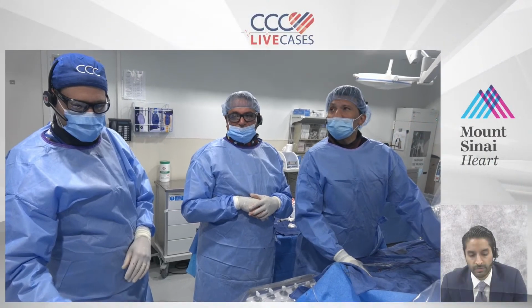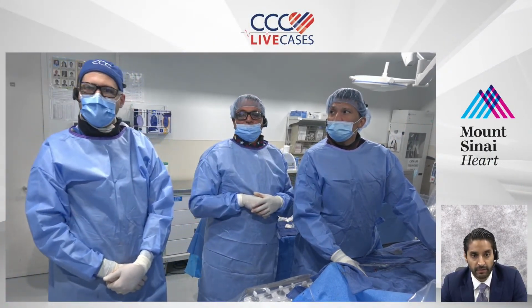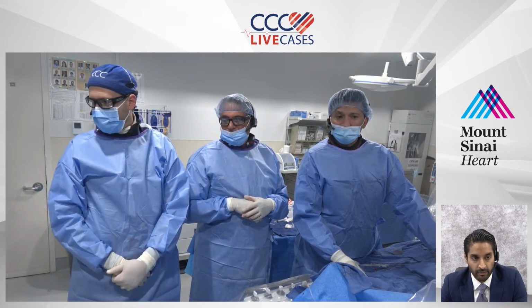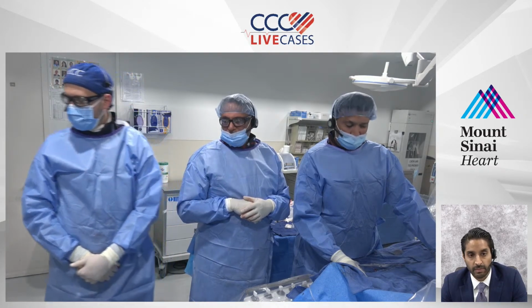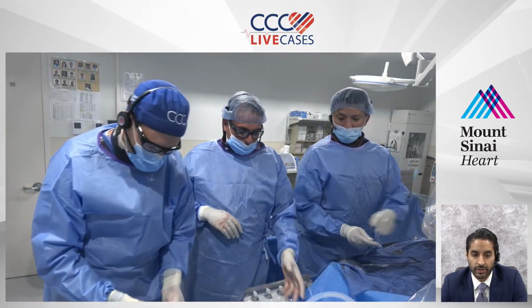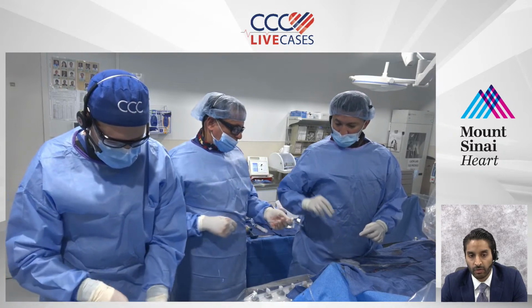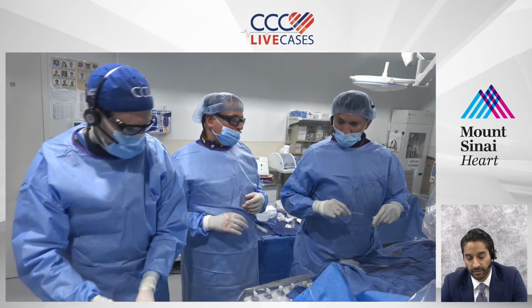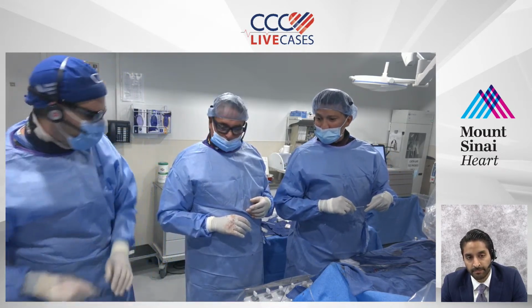Now, another part of the question, this is just today's intervention. This gentleman also has bilateral severely calcific femoral popliteal disease. And we haven't seen the angios for below the knee, but I would presume that there's also some infrapopliteal disease as well. Would you consider just doing some form of stenting almost to preserve your iliac bifurcations to make it easier for yourself next time?